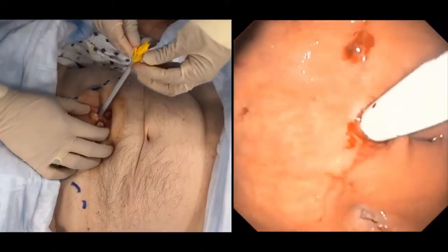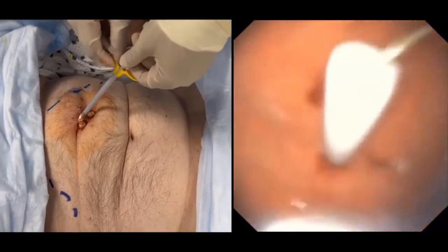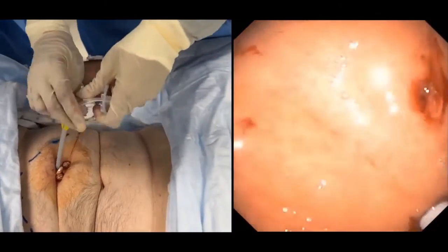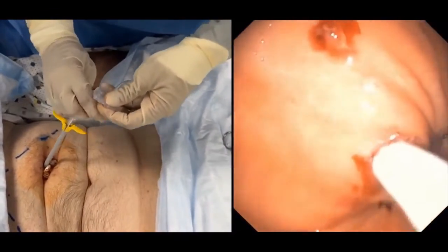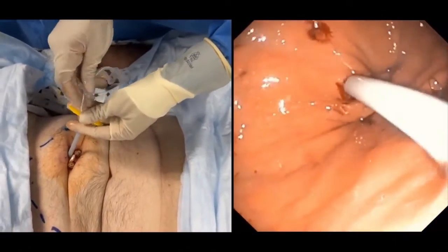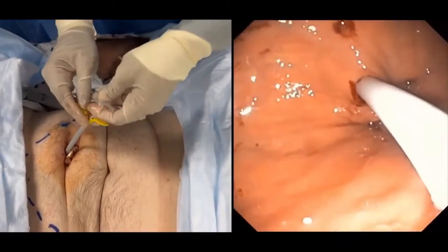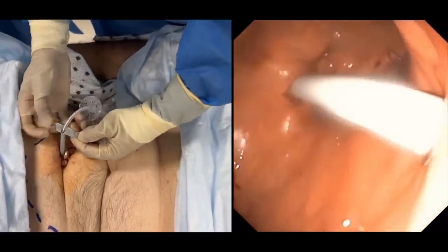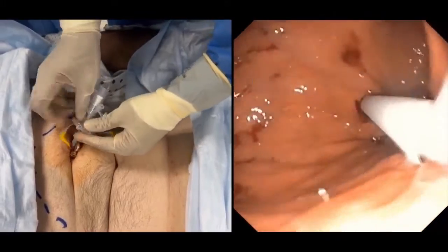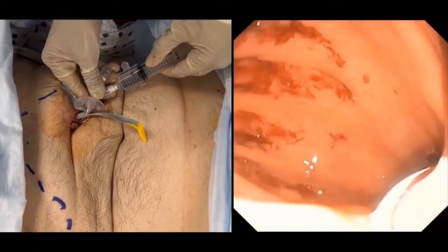Now that we have passed all the dilators, we remove the inner dilators and keep the outer one to pass the G-tube through. We pass the G-tube inside the largest dilator until we see it inside the stomach, then peel off the dilator little by little until we completely see the tube inside the stomach with the endoscope. We then inject the tube balloon with five milliliters of sterile water and completely peel off the dilator.